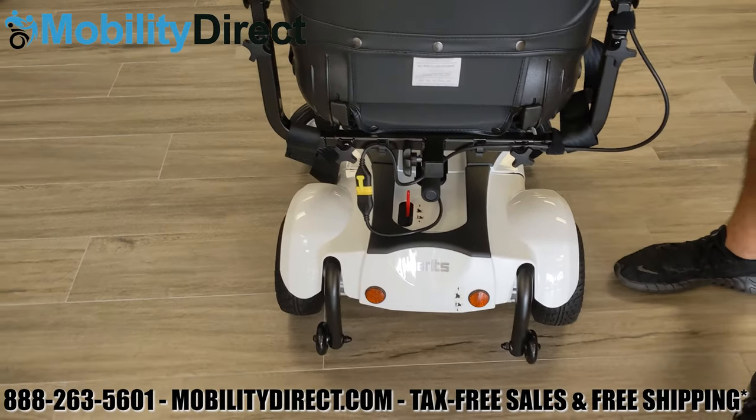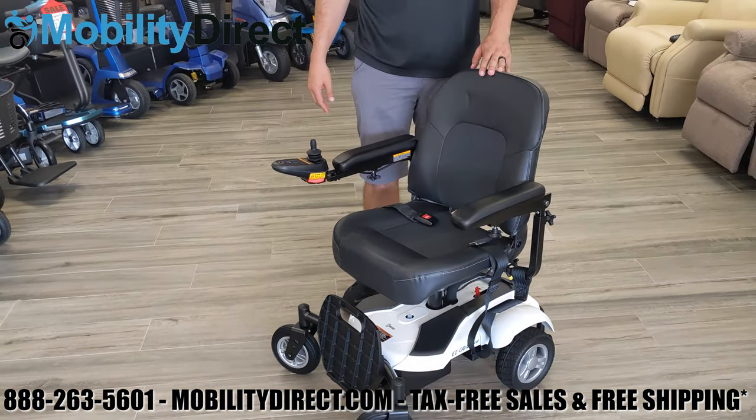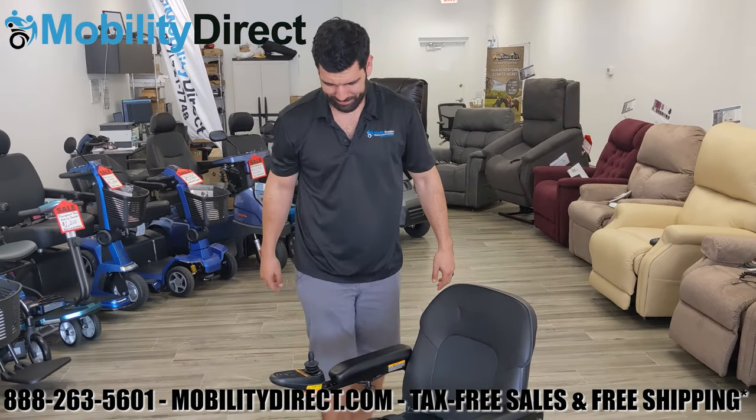There are also anti-tip wheels in the back and the seat folds down. Overall, we highly recommend this power wheelchair. We offer it for sale tax-free with free shipping at mobilitydirect.com.